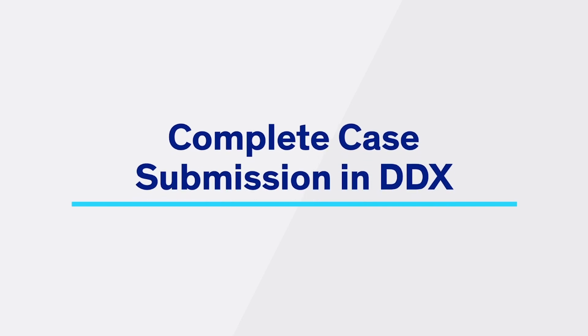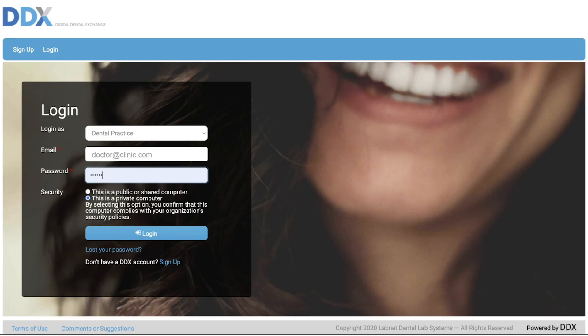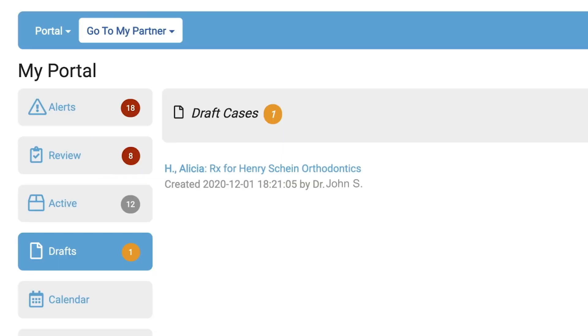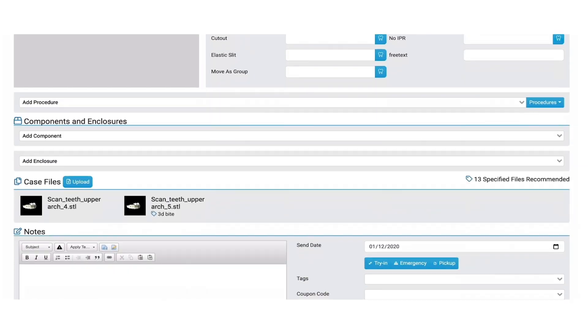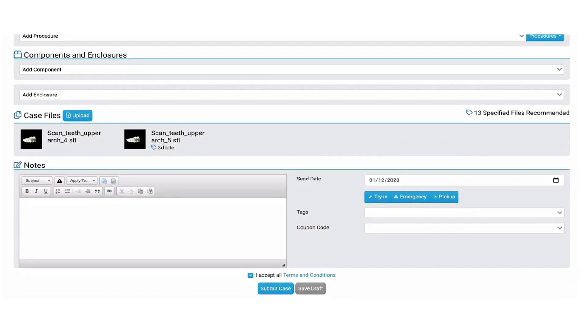To retrieve the draft case and complete the submission, log in to DDX. On the DDX dashboard, click on the Drafts icon. In the Drafts section, you will see a case with your patient's name. Click to open the case. The scans will already be uploaded in the Case Files section. You can now choose the appropriate procedure and continue building your patient's case.